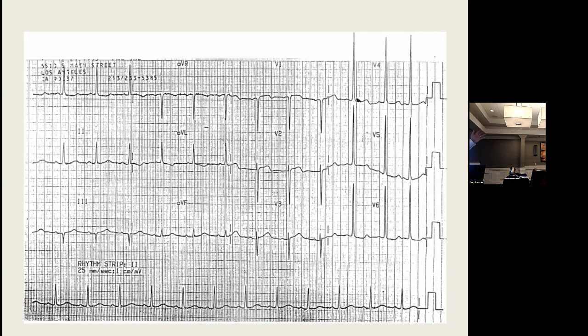Here's the deal. If you can remember 35 and strain in patients age greater than 35, that's 95% specific for LVH. Meaning, if you have it, you've got LVH. Okay, what's the 35? 35 is the S wave in V1 added to the taller of the R wave in V5 or V6. Now, why do we do anything? I mean, this makes sense. Big leads out here. Oh my gosh, maybe the ventricle's really hypertrophied.